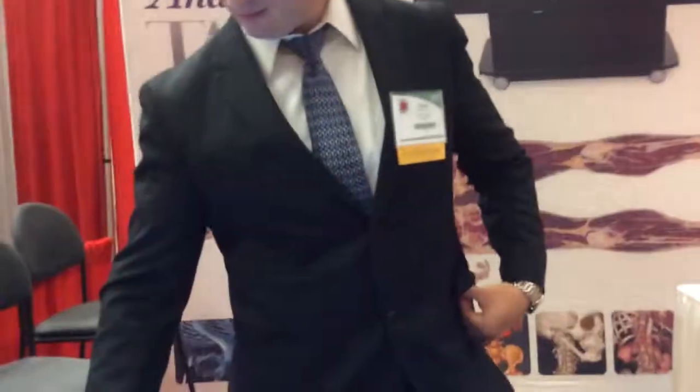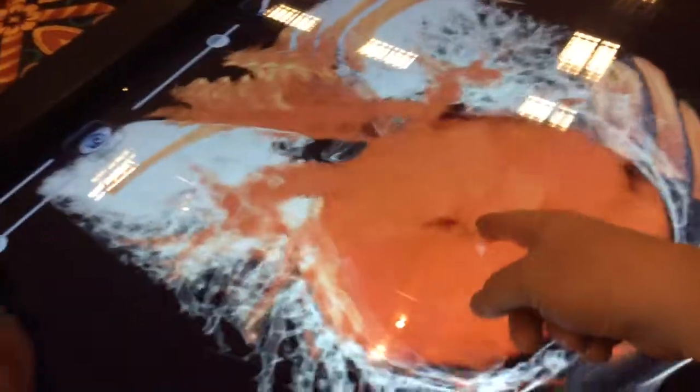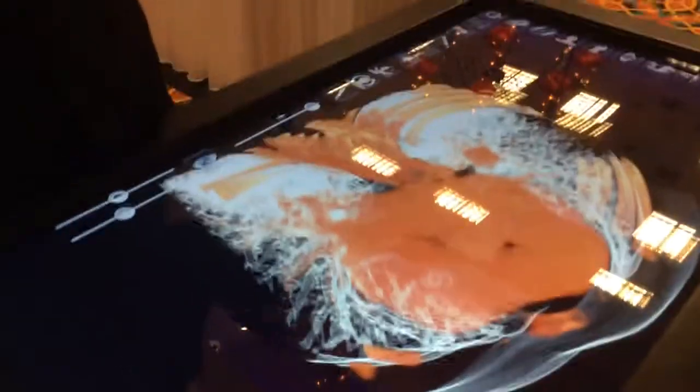That's interesting. Okay. You going to show me something else there? And yeah, so here it's just different rendering visualizations that you can play with here on the table. Oh, okay. Yeah, that looks like a valve, a heart valve. Am I right? I'm not sure if you'd be able to see valves specifically. So does that opening there look like a valve to me? This thing here looks like a valve. Yeah, I'm not sure. Okay. It'd be pretty hard to make out the valve. I mean, you can show where it would be, but on a CT scan, it's really hard to make that out.